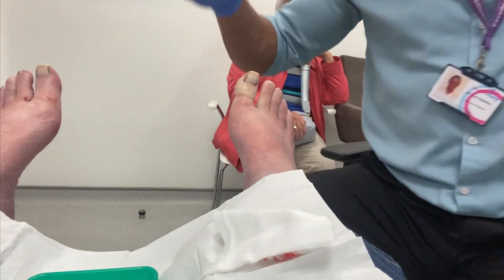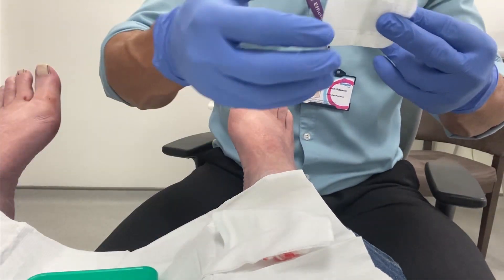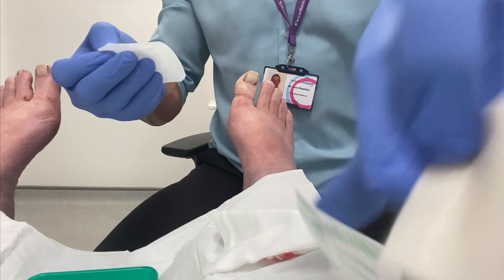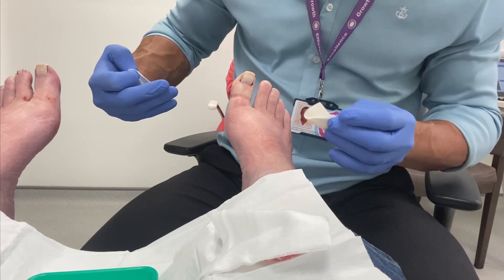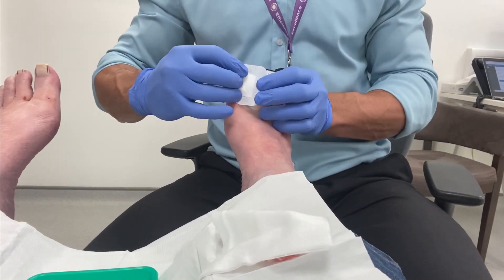Remember to take the tourniquet off, which prevents bleeding during the procedure. We wait until signs of his circulation returning to the digit, and wait until the toe starts to return to a pink colour before we can start to apply the dressing.